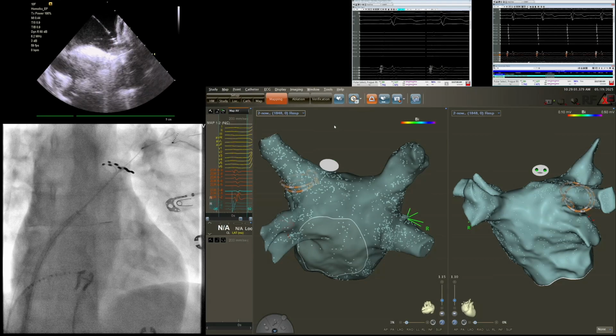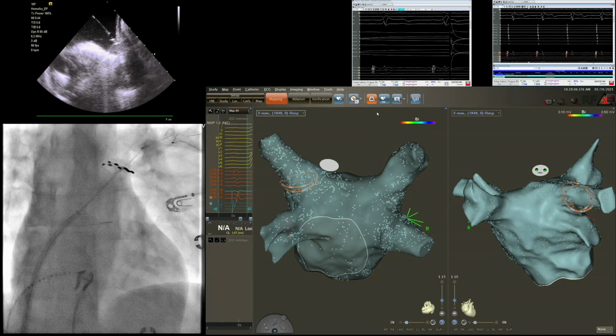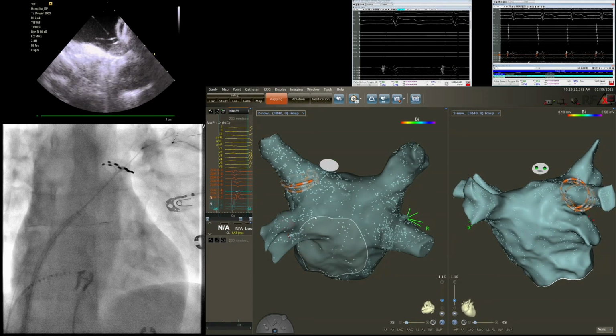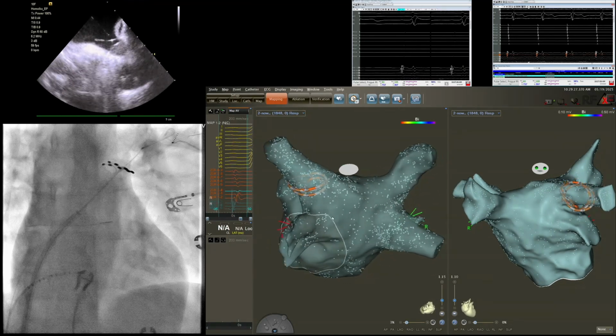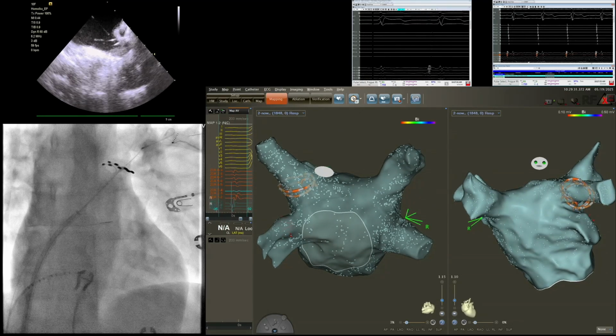So after this, specifically for the superior veins, I really want to get more bonus lesions on the anterior part. Comparing different technologies, and Pepa mentioned yesterday that we are really striking in Czechia, because we seem to have the most experience with pulsed field among the nations. So it's very, very nice.